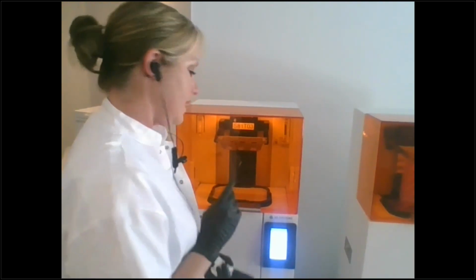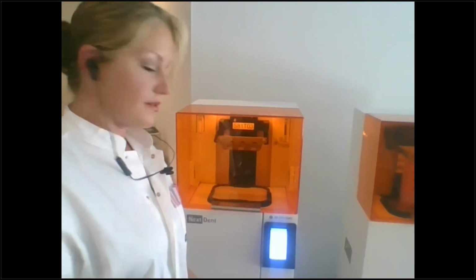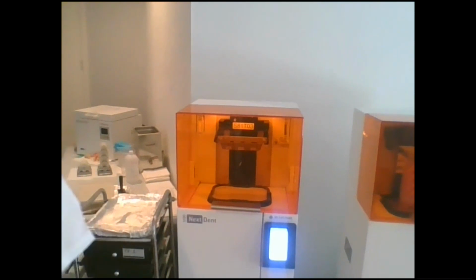So you're going to confirm that your print platform is installed and it's clean, that your resin tray is full, and that your resin has been stirred. So just check those boxes and start your job, and that's all there is to starting the printer.